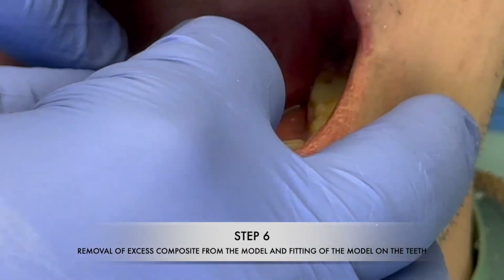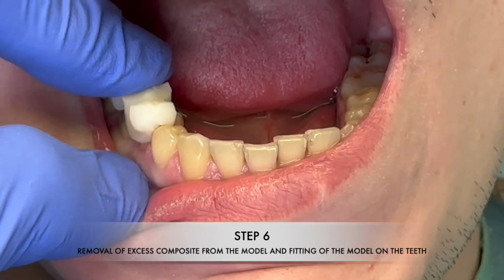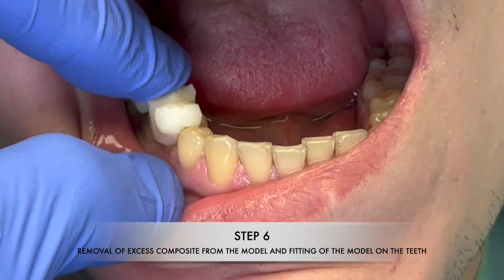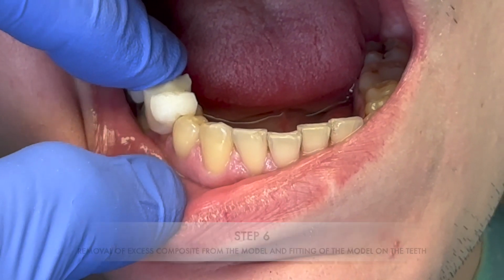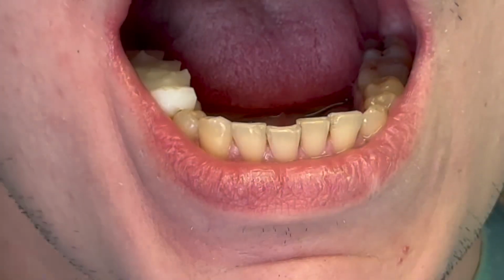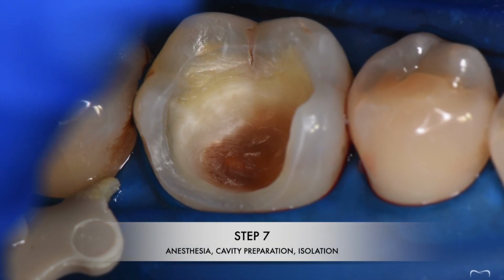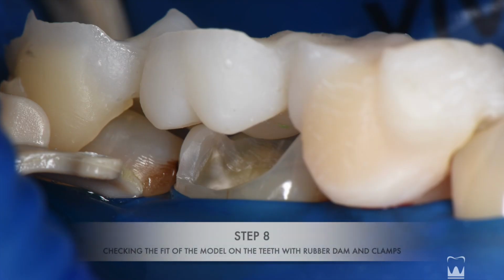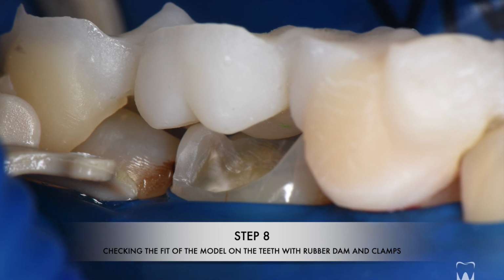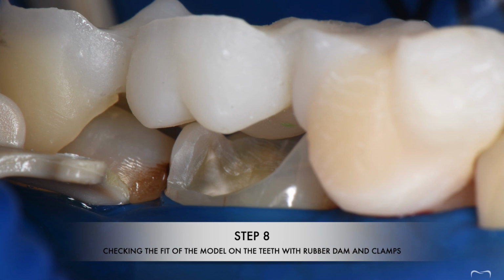Step 6. Removal of excess model resin and flowable composite and rechecking the position of the model on the lower teeth. Step 7. Anesthesia, preparation, isolation. Step 8. Checking the position of the plastic model of the antagonists on the lower teeth with rubber dam and clamps.